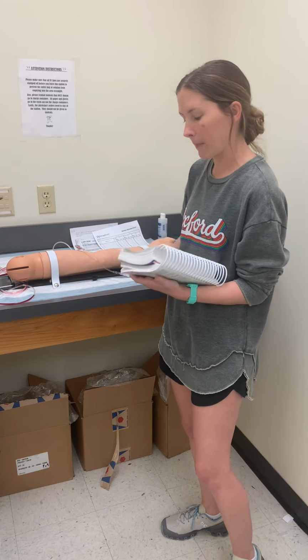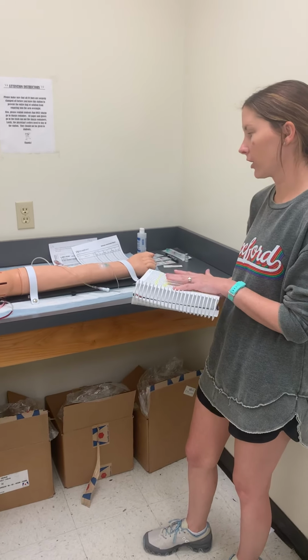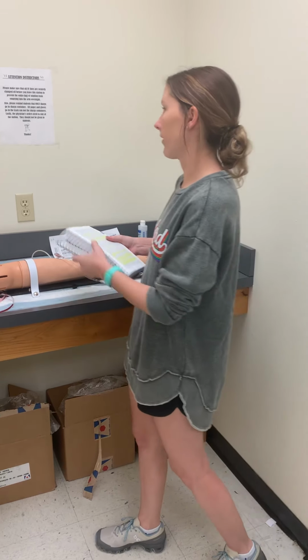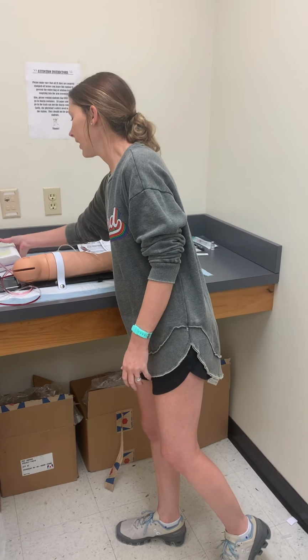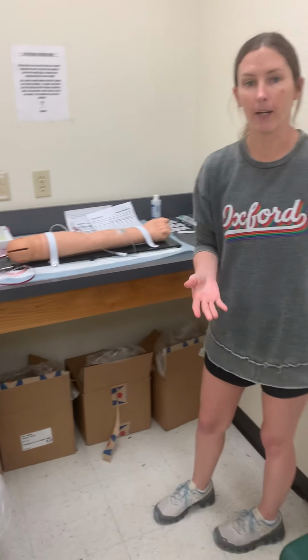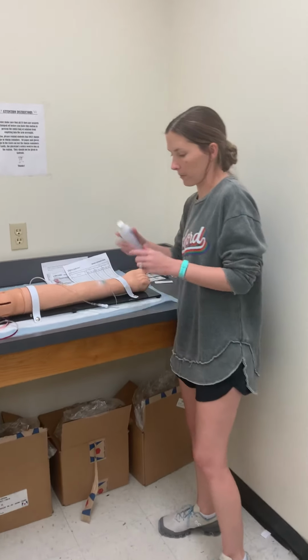All right, so now that I've read about my medication, I know about my medication, I know I have all the safe dosage and that my fluids are compatible, I am ready to start preparing my equipment. So the first thing I want to do is wash my hands.